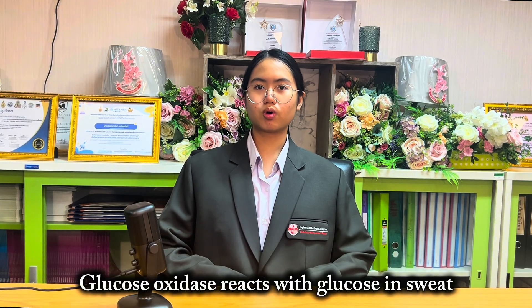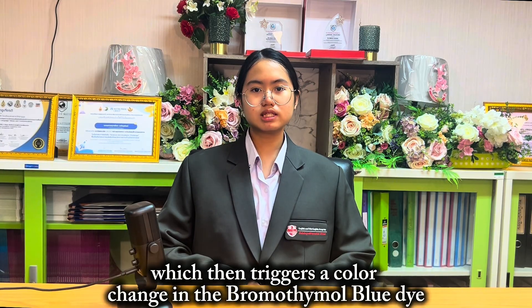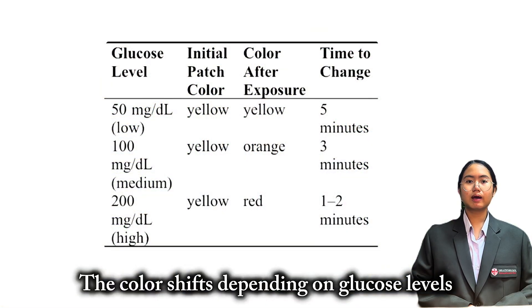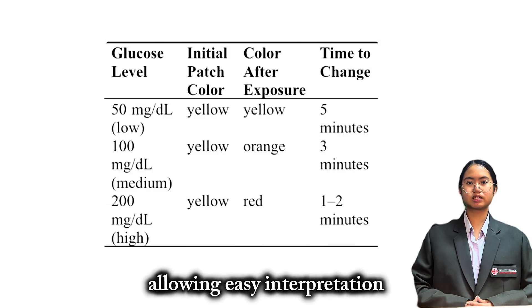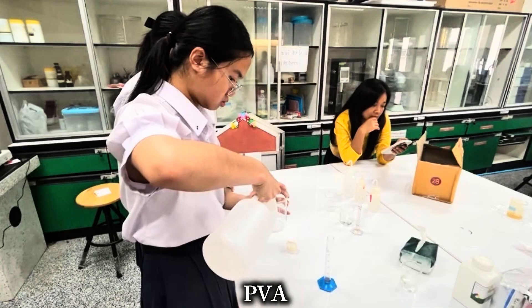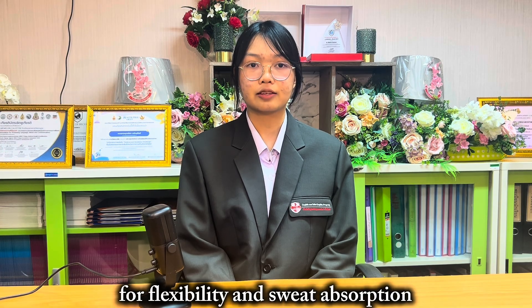The science is simple but effective. Glucose oxidase reacts with glucose in sweat to produce hydrogen peroxide, which then triggers a color change in the bromothymol blue dye. The color shifts depending on glucose levels — low, medium, or high — allowing easy interpretation. We developed our hydrogel using PVA, starch, glycerol and water for flexibility and sweat absorption.